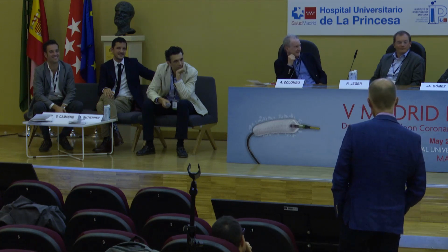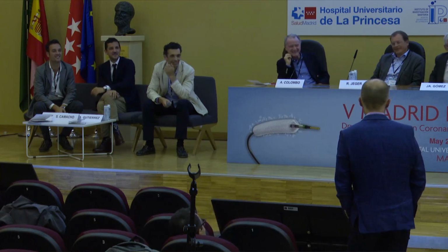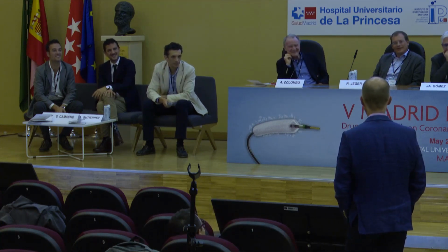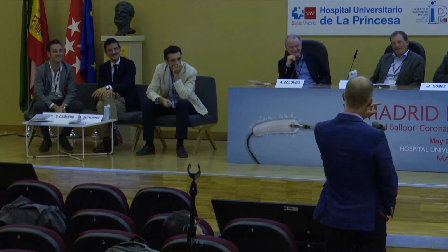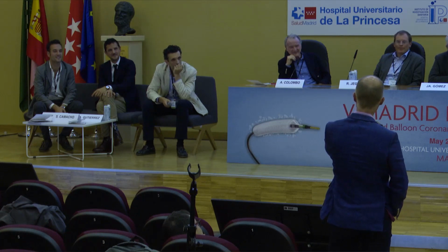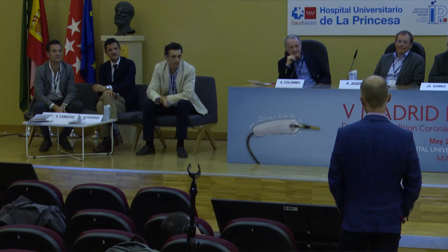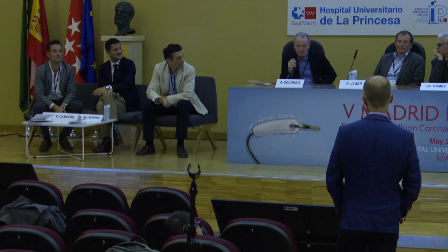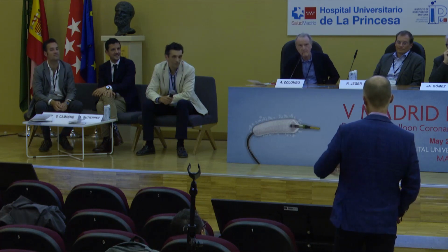Okay, easy answer. We don't have Impella. Worst case. Yeah. So we don't have Impella, so that's not a problem for me. Metaphysical question. I don't know whether you noticed, but at the end of my talk, it clicked on a slide and it said a case, and the case was somebody in their 80s who had distal left main stem stuck on the table with ischemia, an ostial right that was ridiculously tight, and we did all of that with DCBs and some metaraminol to keep the pressure up. So yes, we do. I would start everything with that intention.